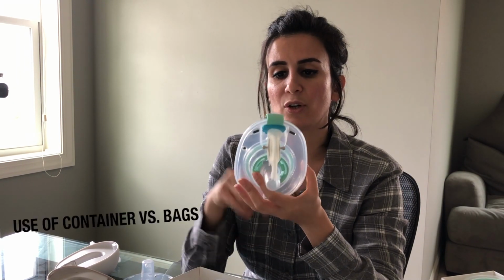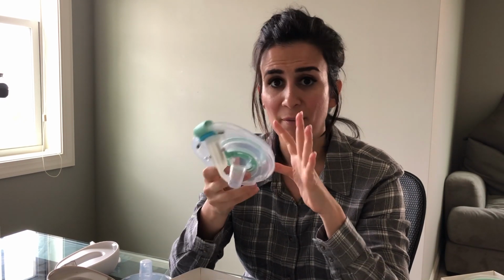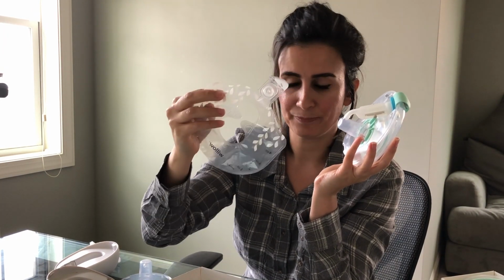Another thing you want to consider with using the container is that you will have to empty the milk out before you can reuse it. If you're in an environment that might not necessarily be clean and you obviously do not want to contaminate your breast milk, such as if you work in a hospital, you're a nurse, whatever it is, you're a doctor, you're traveling on a plane, you don't want to deal with having to compromise your breast milk, that's when it's probably best to use the bags, because once you're done with the bags, you can just put it away and keep it in a closed container.